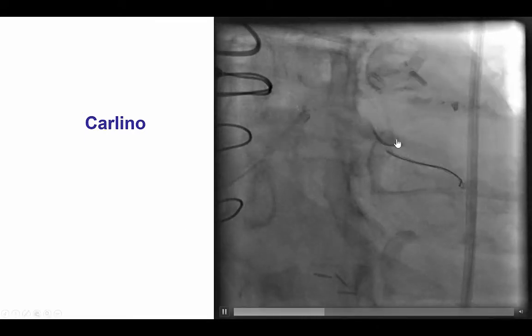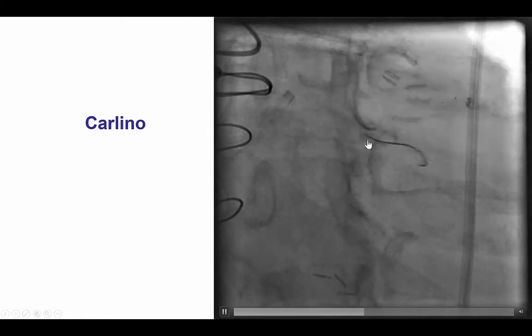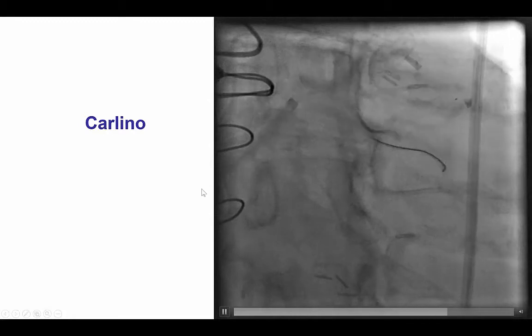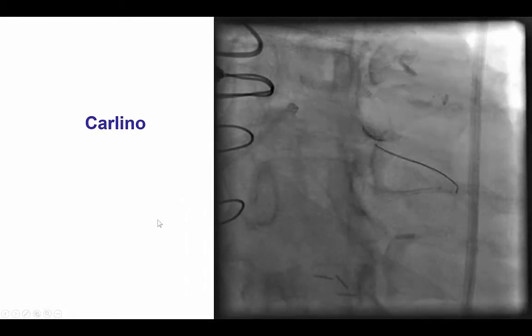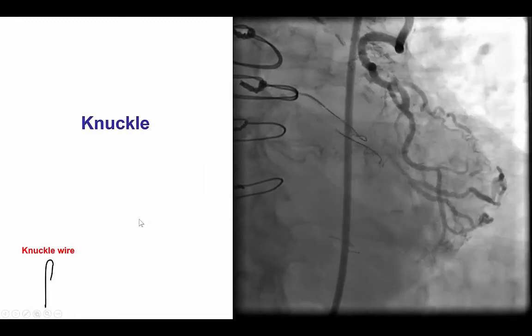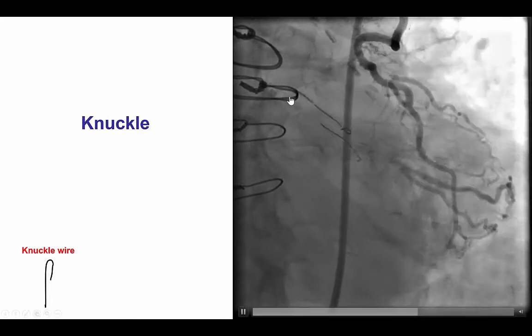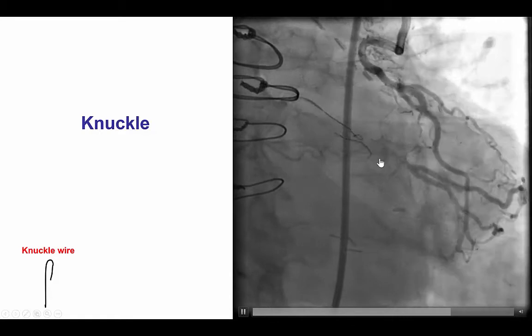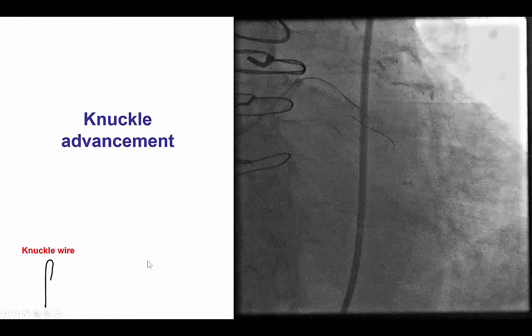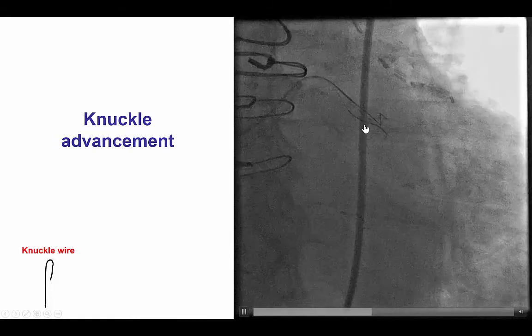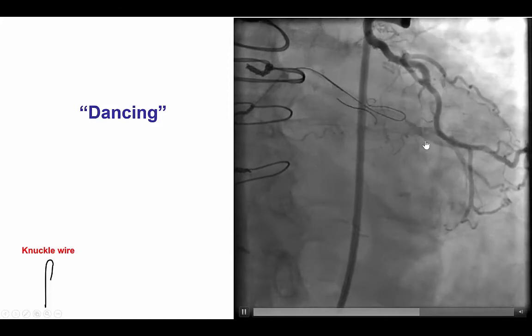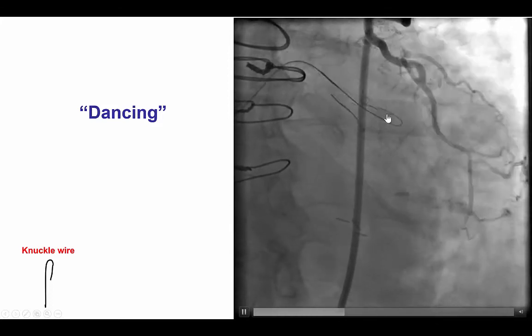So we performed a technique called Carlino microdissection with contrast. We tried several wires, but the wires could not get into the occlusion. We actually wanted to get a wire into that first obtuse marginal branch in order to protect it, but we were unable to do so despite spending several minutes and multiple guide wires. After we did this injection of contrast within the subintimal plane, during attempts to wire the obtuse marginal, the wire suddenly prolapsed into a plane which seemed to be moving in sync with the distal target vessel. We then advanced the microcatheter into the occlusion and took a Fielder XT guide wire, which was pushed to form a knuckle.